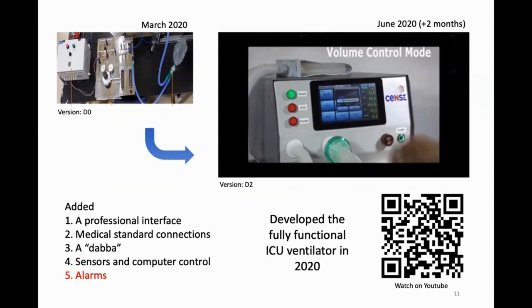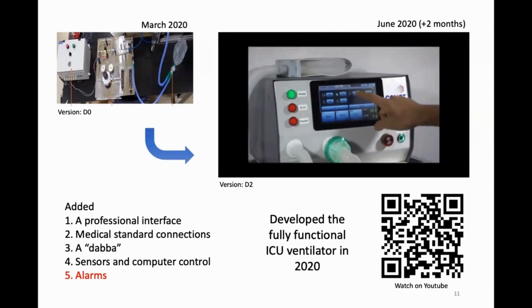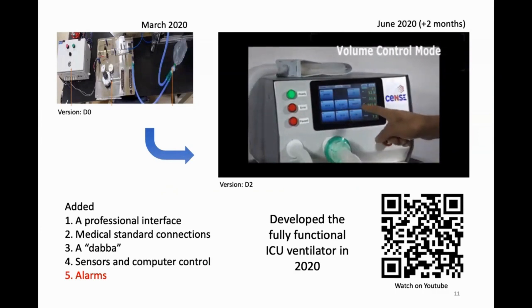It was a dabba, and that is kind of important. And there were sensors, computer controls, and most important of them all, it had alarms. Finally, you could actually talk to doctors in a reasonable fashion. And we were very happy. But unfortunately, it was June 2020.